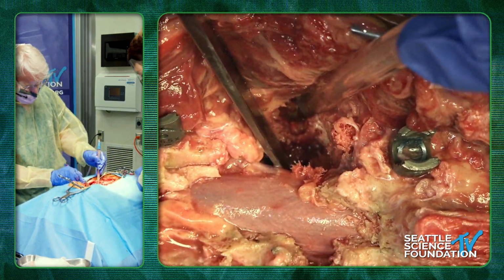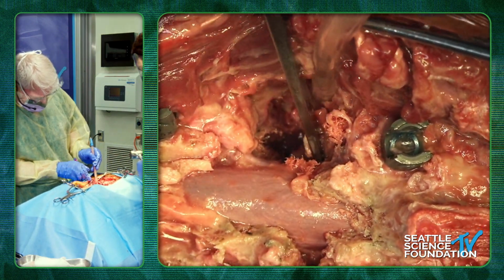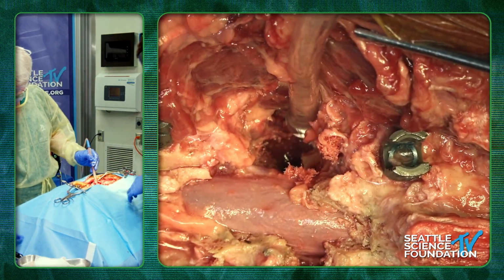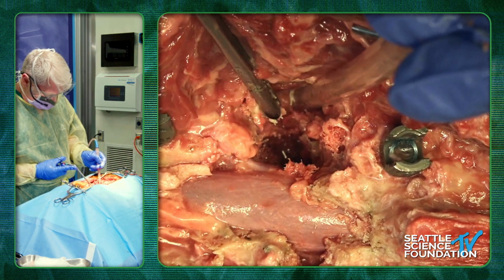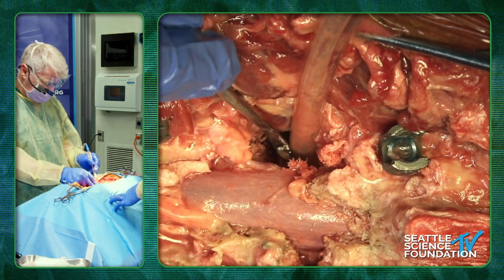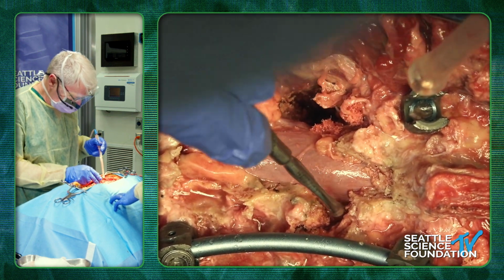And we're going to keep the cut coming lateral to the other side. And I'm going to go through the disc space again with this one. Okay, so now I'm all the way underneath dura. Pituitary again. And so the body's decancellated in a triangular fashion, and the posterior wall is still intact. So that gives you that kind of, it won't collapse on you. And then at the end, that'll be the last thing I'm going to break down. Then, because I'm already all the way through to here, we're going to do the rest from this side.